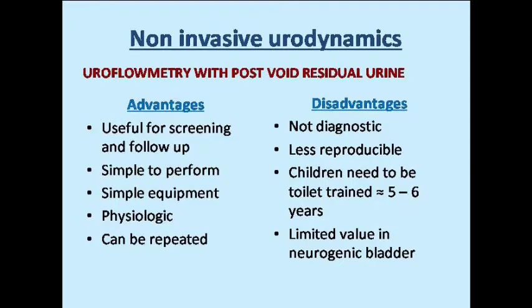So this has all been dealt with already. The flowmetry is going to be talked about, but the most important thing is it's a very simple test, very simple to perform, but not in children who are not toilet trained. Obviously, you cannot get a child who is not toilet trained to do a flowmetry. But apart from that, in older children, flowmetry is very useful. As in adults, it's a screening tool. It tells you that if the flow is abnormal, then you need to decide why the flow is abnormal, and if you need further answers, then you need to proceed to invasive studies.